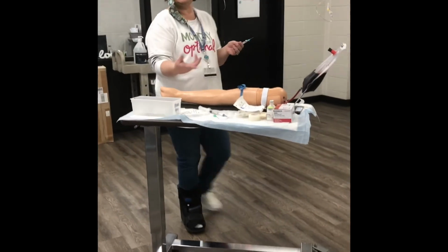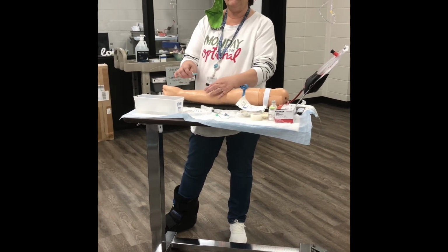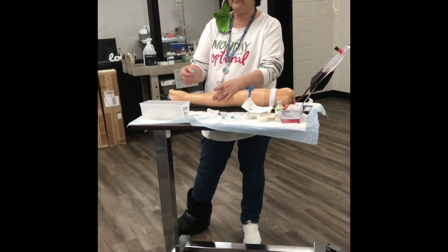But you can't hold these from underneath. So you're either going to have to go over your thumb, or you're going to have to do it from the side. Now, if you do it from the side, don't put your hand up where you can't see where you're sticking and you're over your clean site, okay? Just kind of put it down. I'm going to displace the skin.